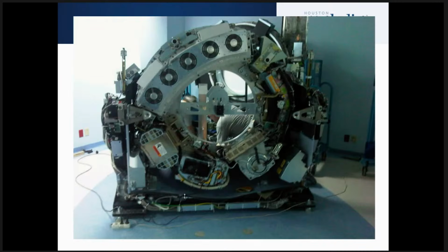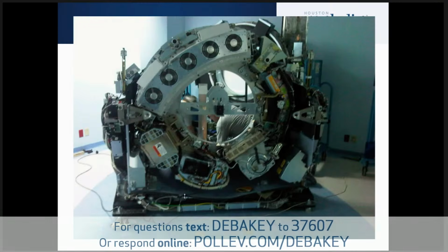Now we are covering primarily the entire circle of the patient. And this is very important because it has important implications for the detection of the photons that we get during the imaging procedure, as we will describe a little bit later.